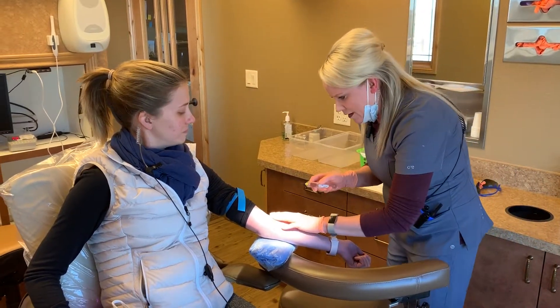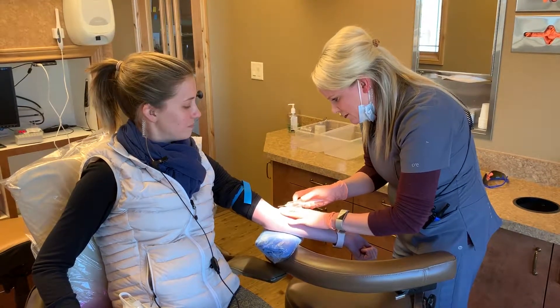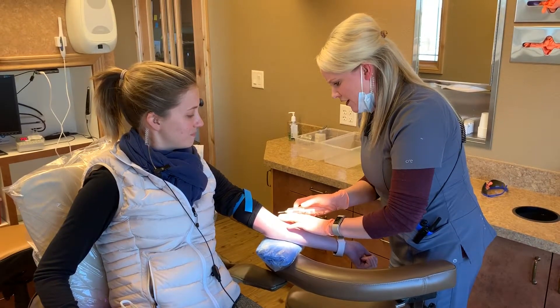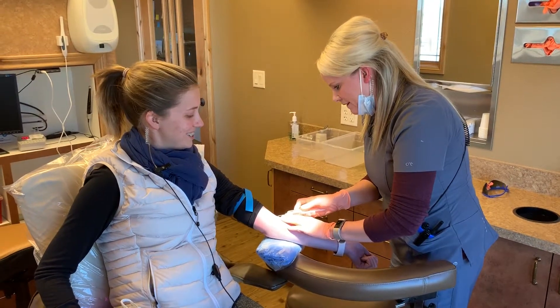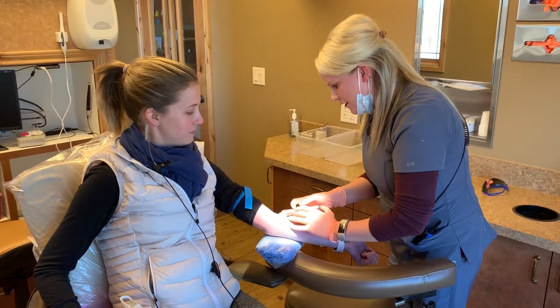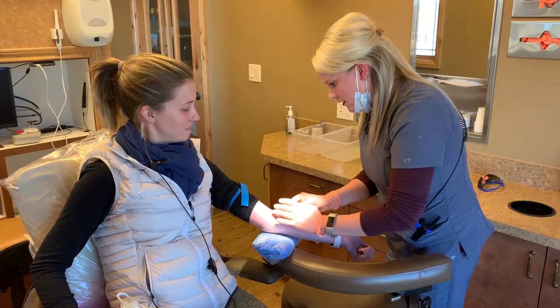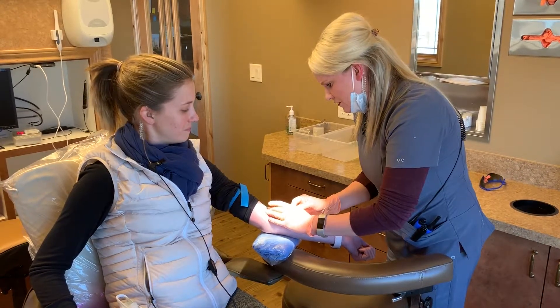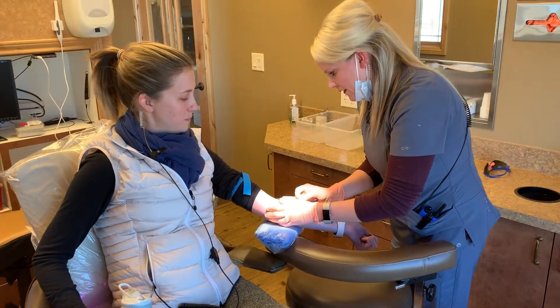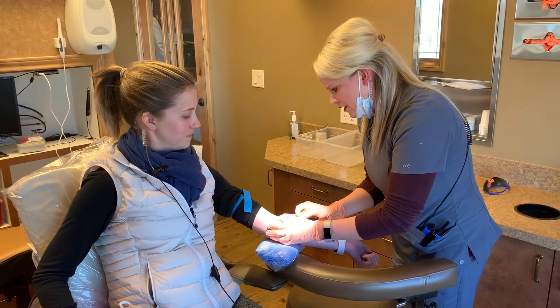So Bobby, you're going to feel a little pinch here. Okay. So here we go. Got no pressure, huh? Not at all. Nice poke, Tara. Thank you. There we go. We may have to do take two. Oh, there we go. So you can see the tube here is filling up.